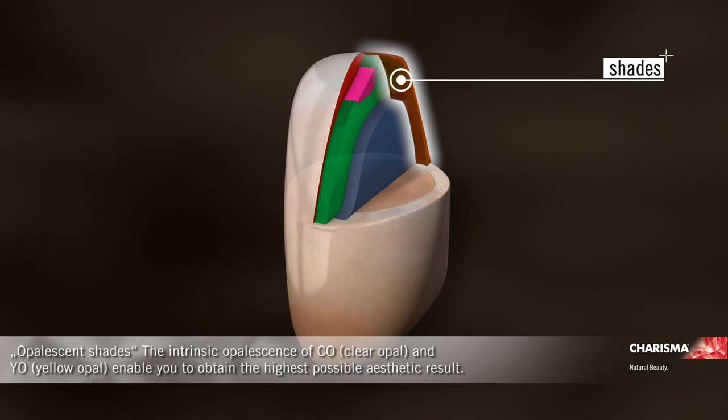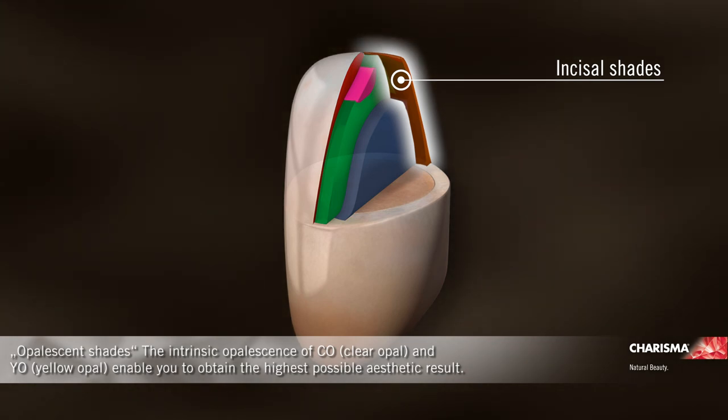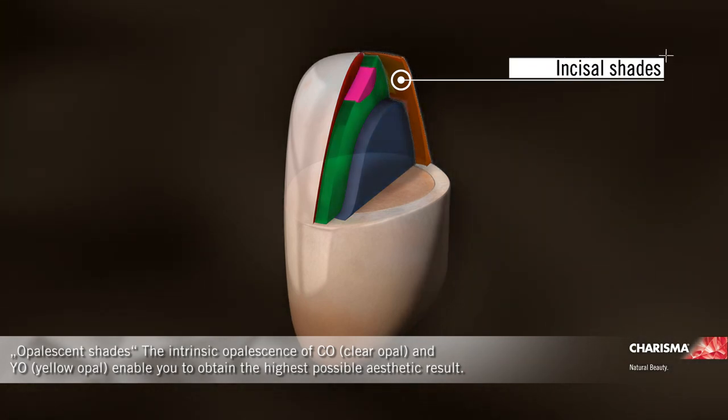Opalescent shades: the intrinsic opalescence of CO clear opal and YO yellow opal enable you to obtain the highest possible aesthetic result.